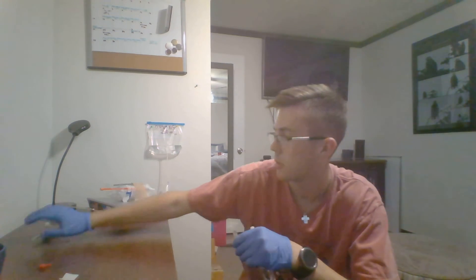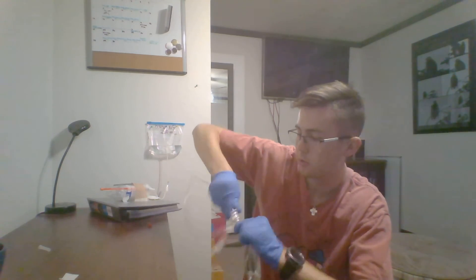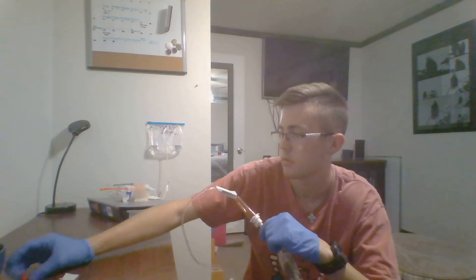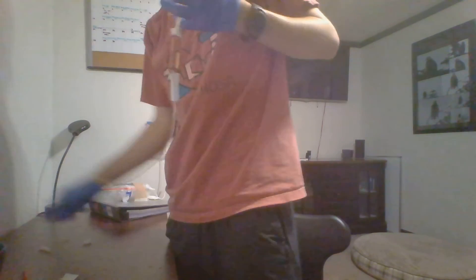Gently agitate the medication to mix it up. I will then spike my IV tubing, turn it upright, and fill my fill chamber to about halfway. Then I'll do my best to get all the air bubbles out without wasting a lot of medication.